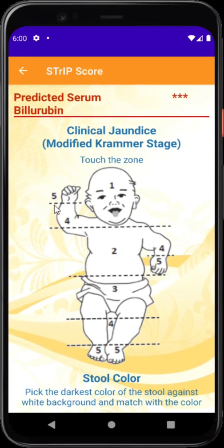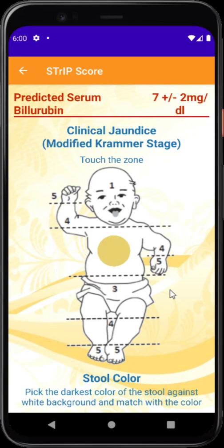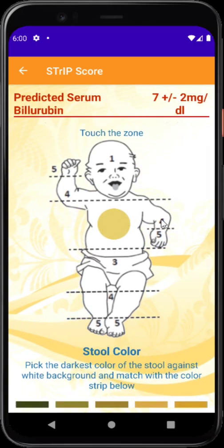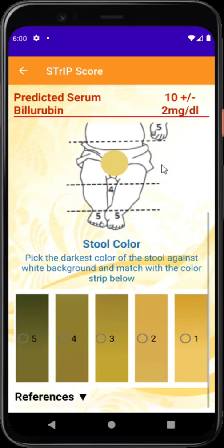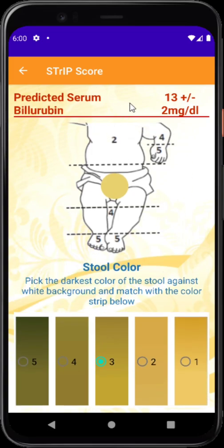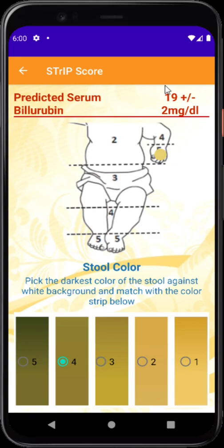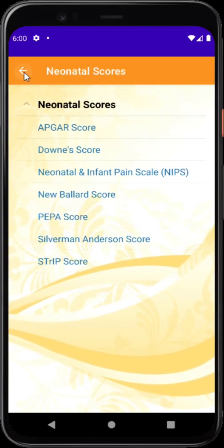Another recently added score is the STrIP score — a modification and improvement of the Kramer scale for clinical assessment of jaundice. You select the clinical zone of jaundice — zone 2, 3, or 4 — and match the skin color to a color strip. Selecting the closest match gives the predicted serum bilirubin — for example 13 mg/dL ± 2 mg/dL. As you change the clinical input or color, the value updates. It is reported to be better than transcutaneous bilirubin.